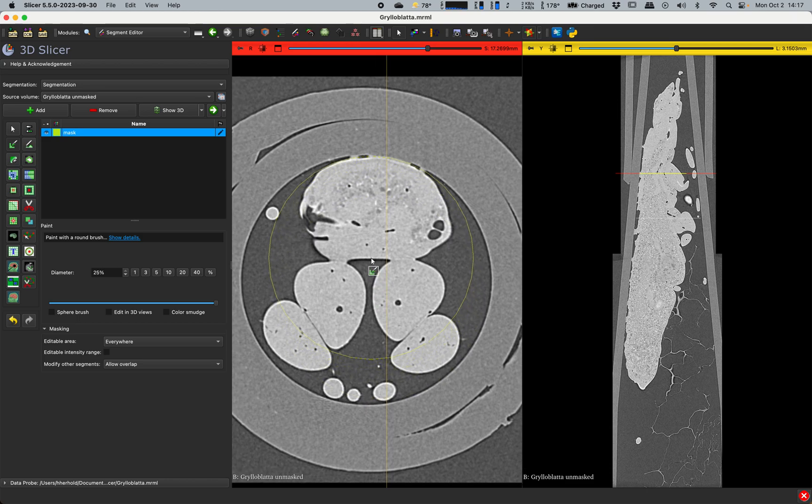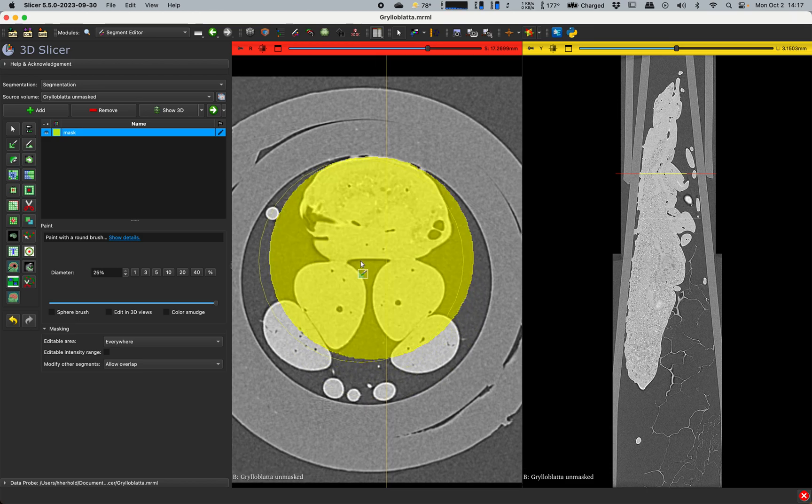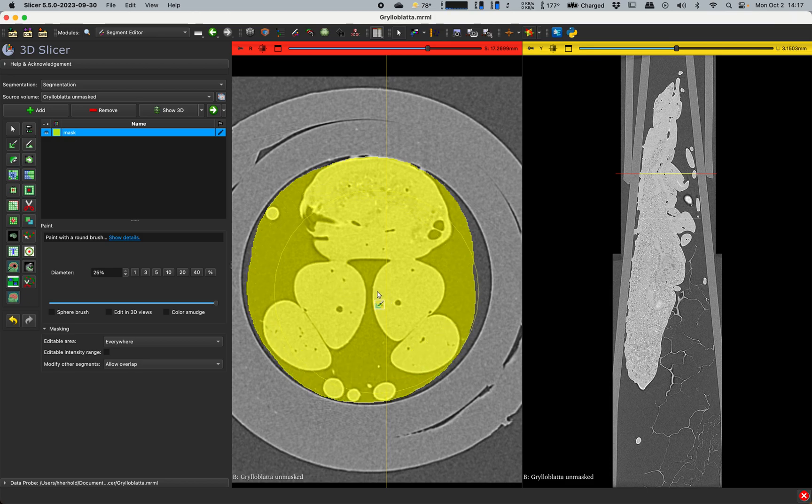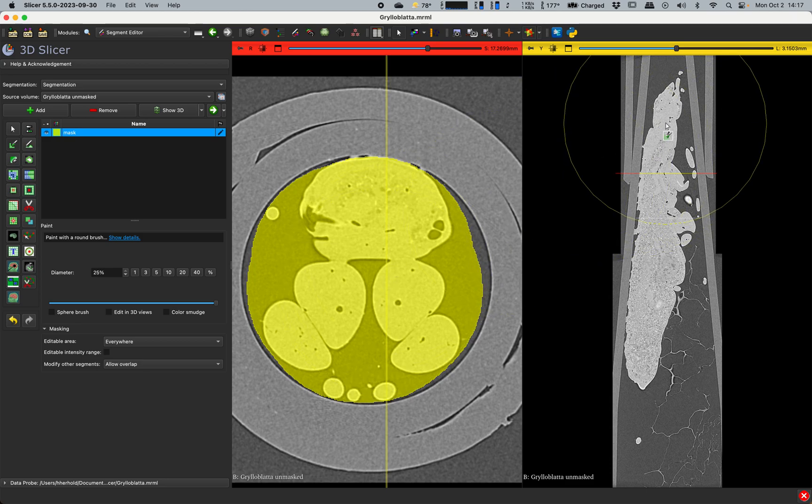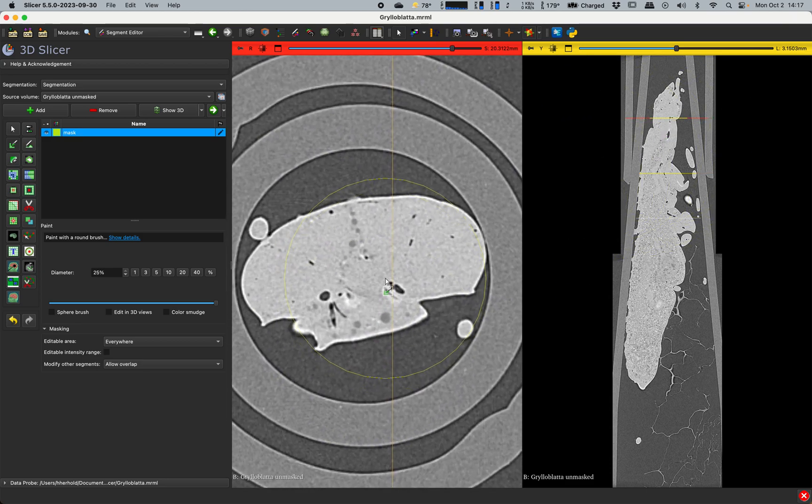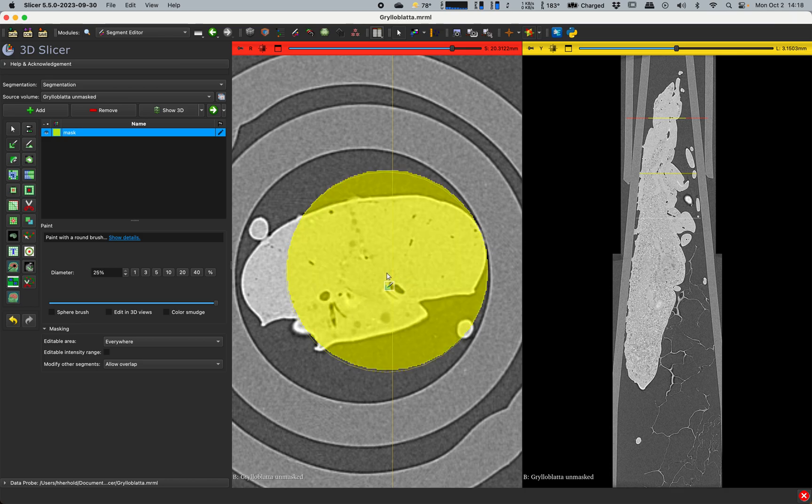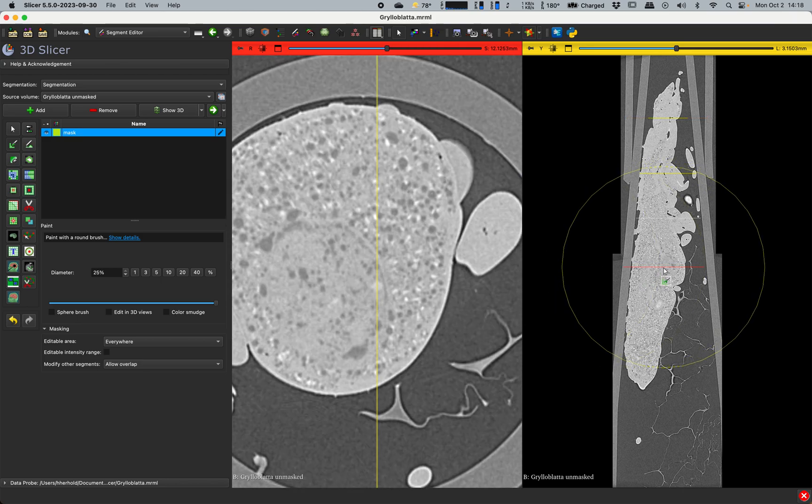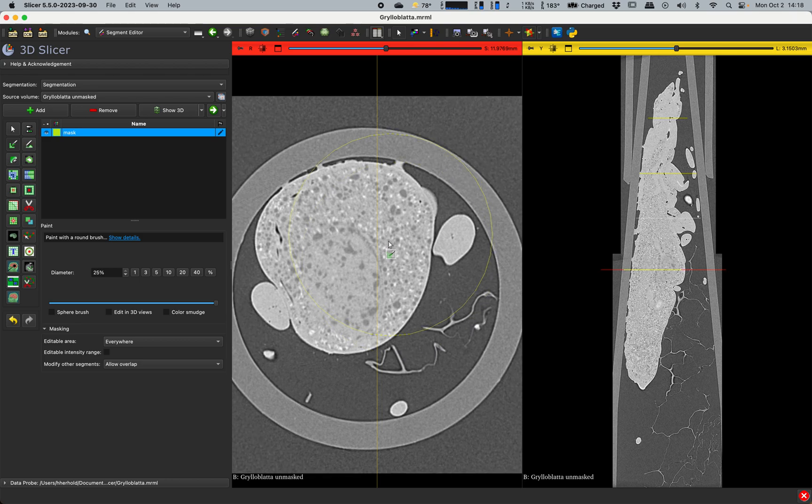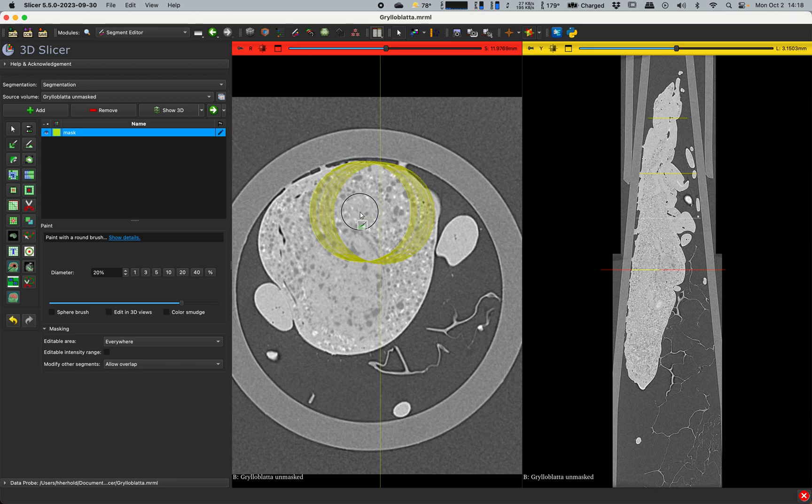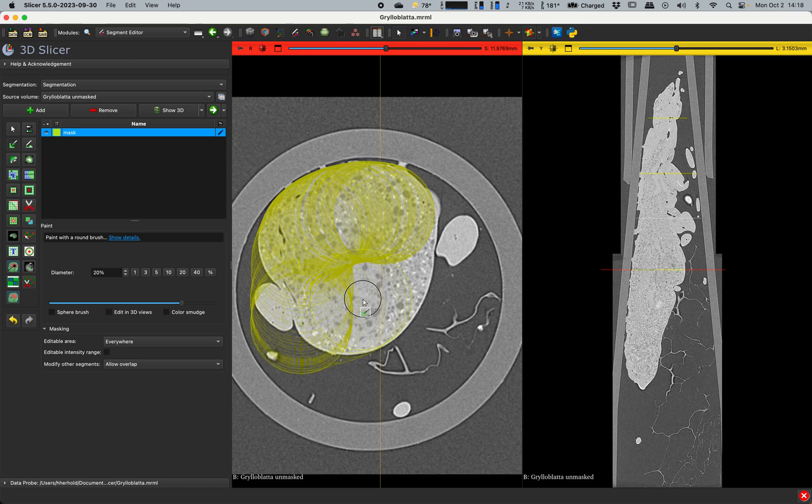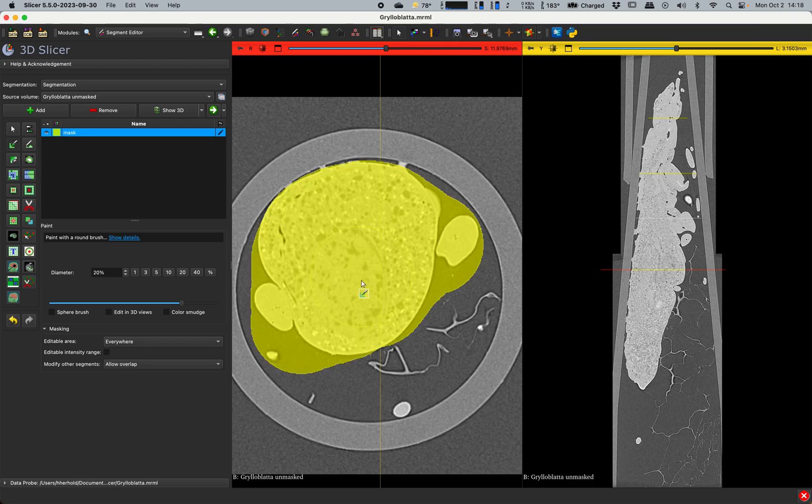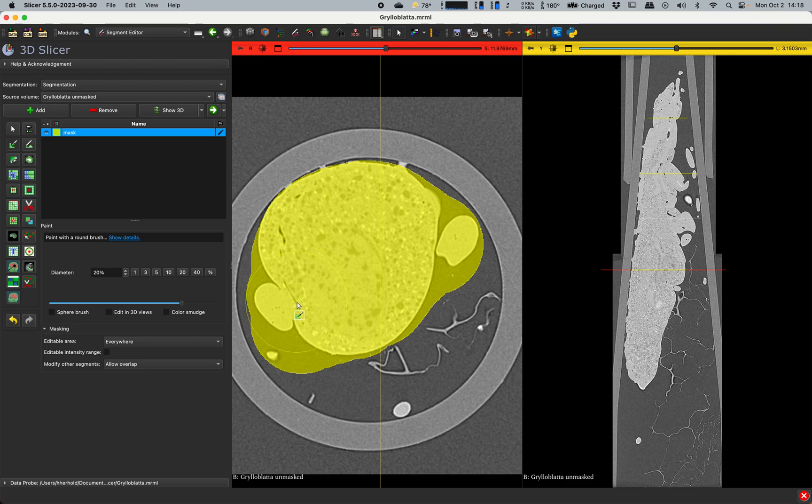Then I'm going to move to another spot up here. I use the shift key and move the mouse to sort of jump the slice to where I want it to be. And I'll do the same thing here. I'll zoom in and I'll paint here. And then I'll move up a little more. There's a little bit of judgment called for in how far apart each of these slices needs to be. You'll see in a moment why and how this works.